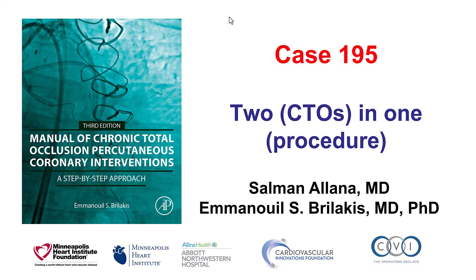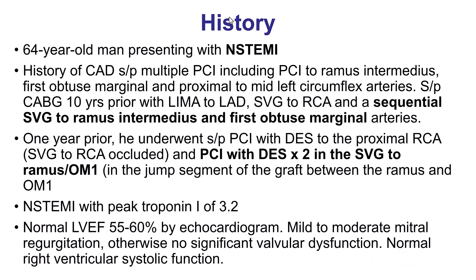This is a case in which two CTOs were re-canalized in the same vessel in the same procedure. The patient had previous coronary bypass 10 years prior with LIMA-to-LAD, a vein graft to the right that had occluded, and a sequential vein graft to the RAMUS and the first obtuse marginal branch.